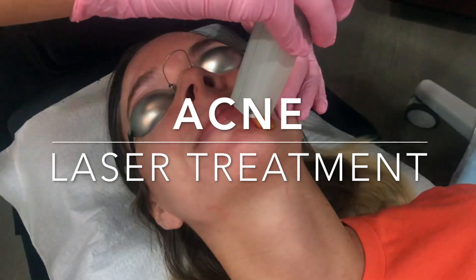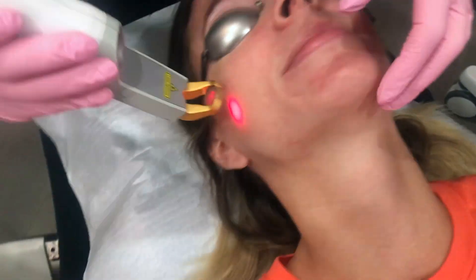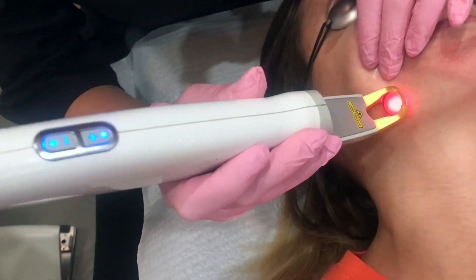We're treating acne and we use two or three different lasers when we do this. We're using the XLV laser 532 right now. That's a more intense beam and that spot treats the active acne and it dries them up pretty quickly.